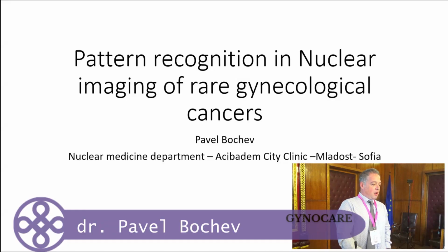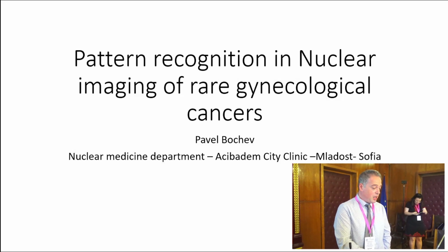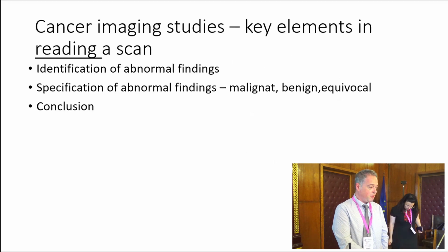Okay, so I'm a nuclear medicine specialist, working at Acibadem City Clinic, Sofia. I will not focus exactly on nuclear medicine imaging, but on imaging in general, because the problems and the solutions are the same.